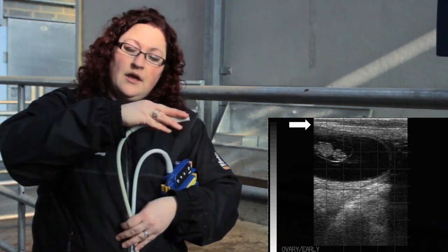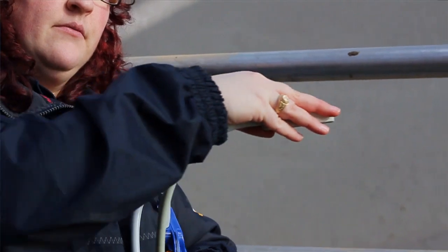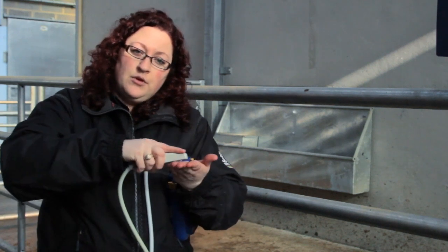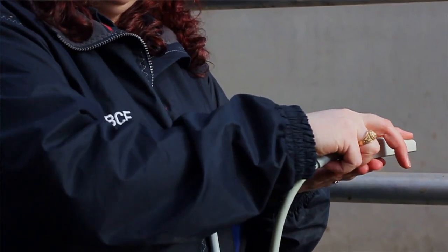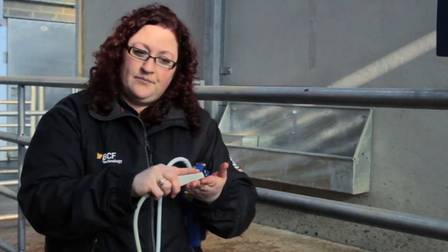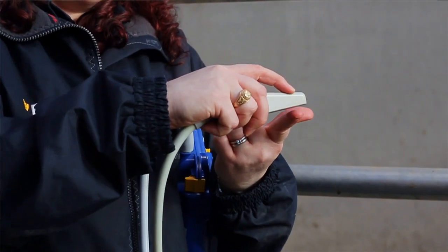So I know as I move forward within the cow or backwards, I will know how that relates to the image that I'm seeing. If I move the probe towards the left or forwards within the cow, the ultrasound image will be coming from the left. So anything that is on the left side of the screen will be translating to this part of the probe.